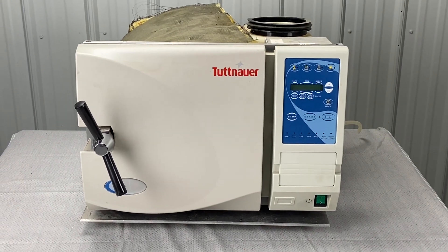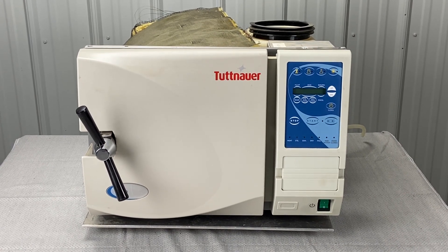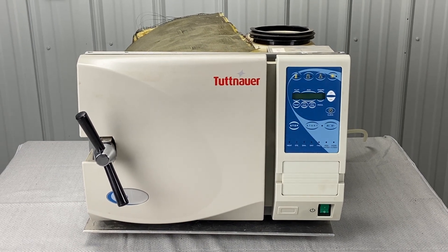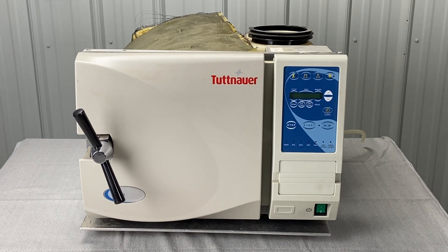Andrew here with Sterilizer Autoclave Solution. You can reach us at 704-966-1650, option 3 for free tech support, or visit us at statumusa.com. We're going to do an annual preventative maintenance kit replacement for an EZ9 or EZ10.